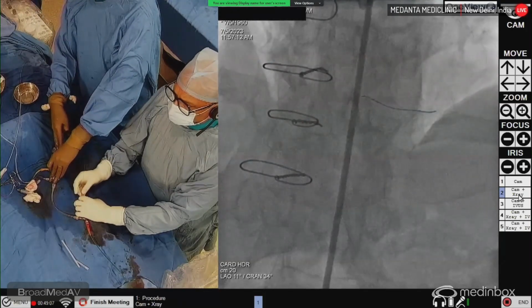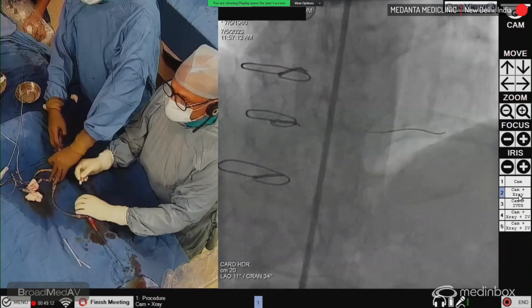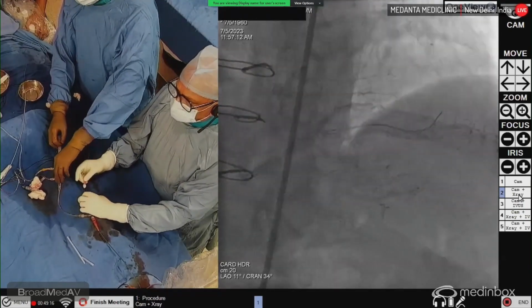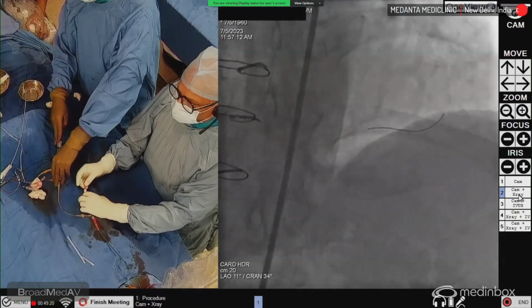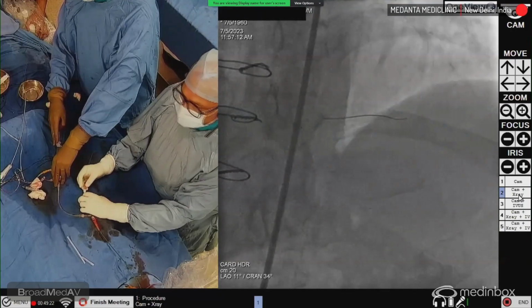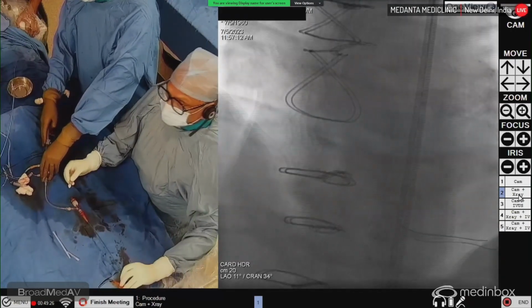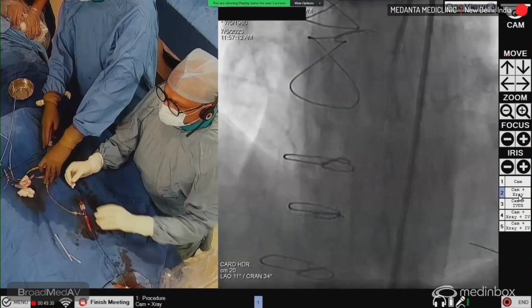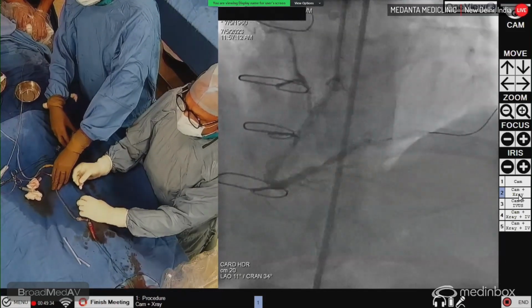Epicranial. Check, please. Oh, yes, the guiding has jumped. Okay, come back. Let me see the guiding. You saw? Suddenly I saw there was a jump in the wire, which means that the guiding has backed off a little bit. So I will see. Check, please. Yeah.